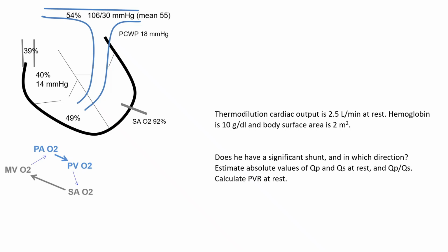So calculate here the QP/QS. This is a patient who has a big left to right shunt, right? You have a big step up. And you're thinking with his big left to right shunt, he is having some PAH, look at that, pulmonary arterial pressure, and maybe he's having some reversal of shunt. So it fits that this arterial saturation is due to some right to left shunt.